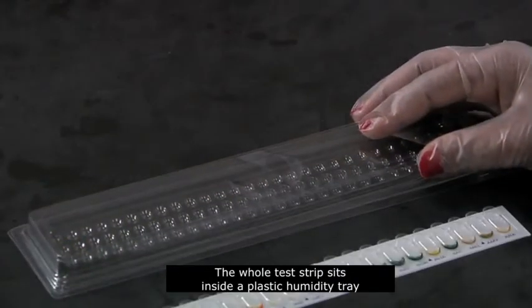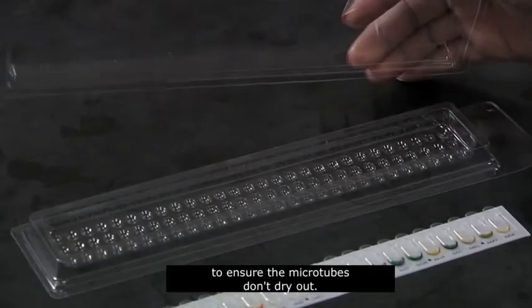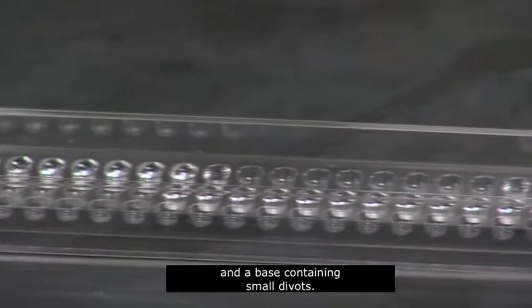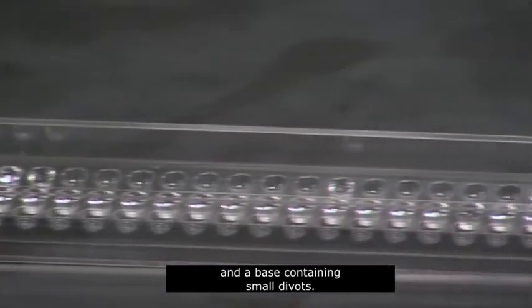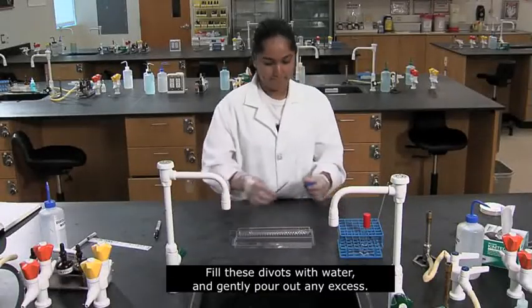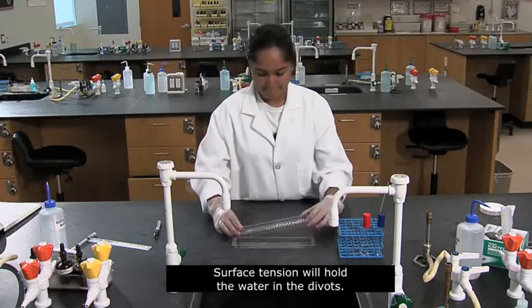The whole test strip sits inside a plastic humidity tray to ensure the microtubes don't dry out. The tray has a smooth, clear lid and a base containing small divots. Fill these divots with water and gently pour out any excess. Surface tension will hold the water in the divots.